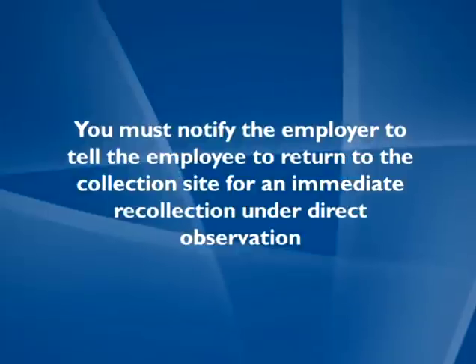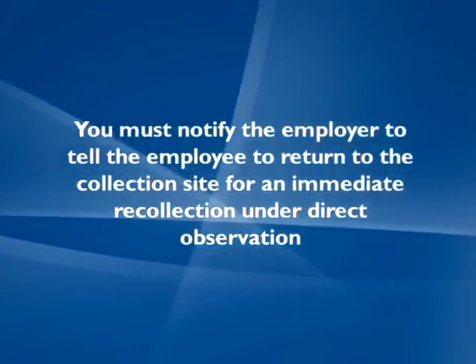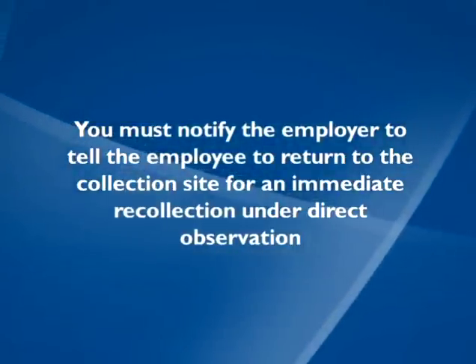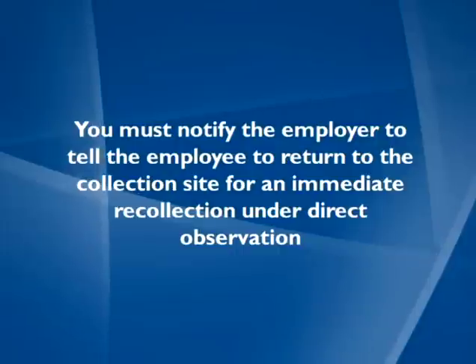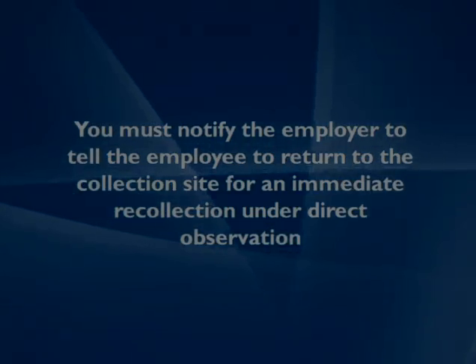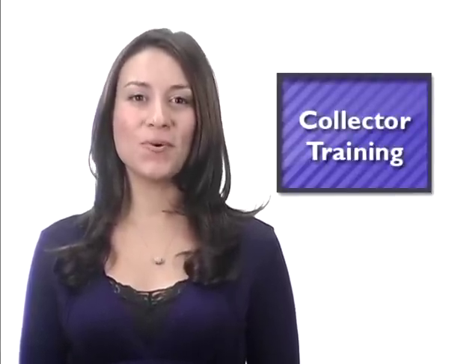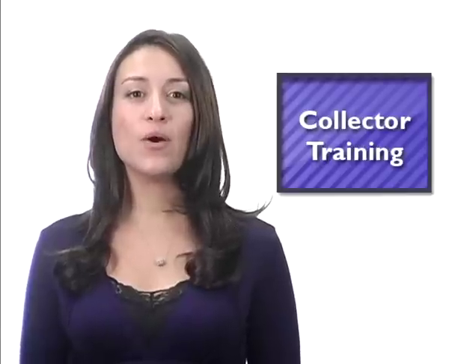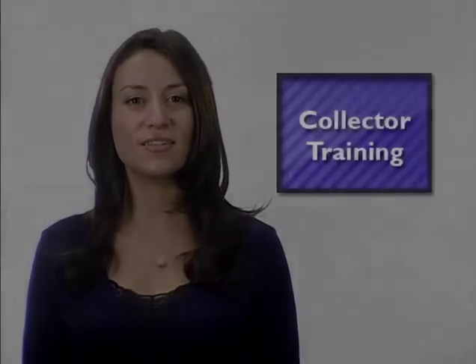In this situation, you must notify the employer to tell the employee to return to the collection site for an immediate recollection under direct observation. When another collection is necessary, begin the collection as soon as possible. Be sure to use a new CCF and collection kit. Let's listen in as our experienced collector, Tony, tells Contessa about the 4 types of fatal flaws that will cause the MRO to cancel a DOT drug test.